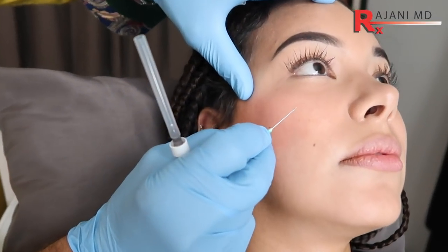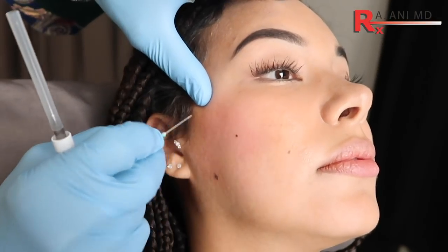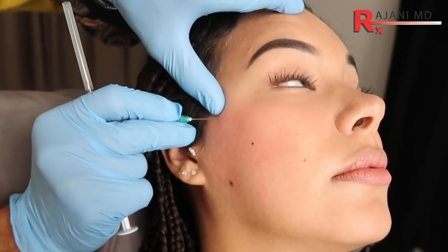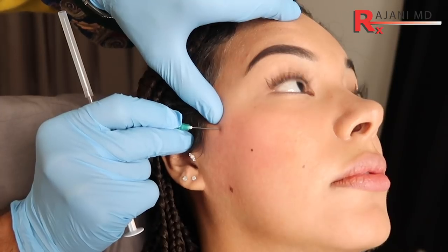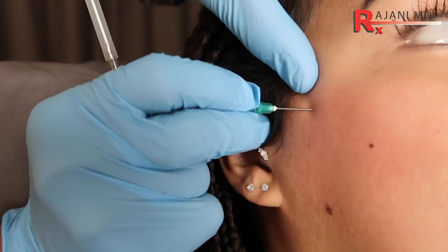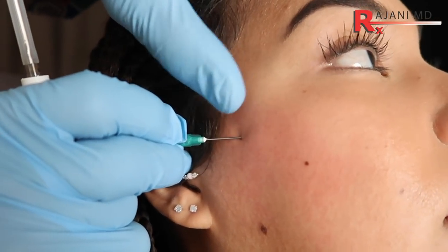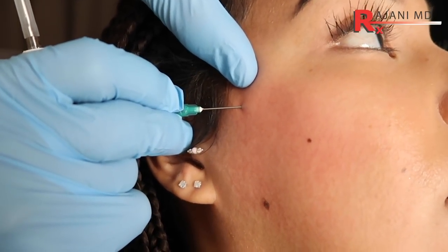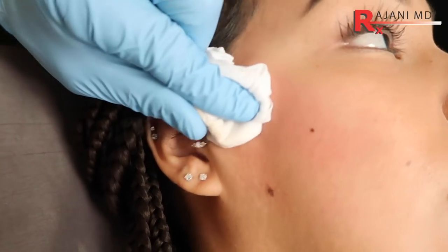So here we're going to do cannula high cheek. When I'm eyeing it up, I'm looking at my parallel lines — the jaw line and the cheek — and I want to make those parallel. I wanted to make a nice high, beautiful cheek for her. I see a little vessel here so I'm going to come in front — a little poke here. You don't have to go in beyond the dermis. Any more would just be creating a bruise. I'm not using the sharp, and that will help avoid a bruise.